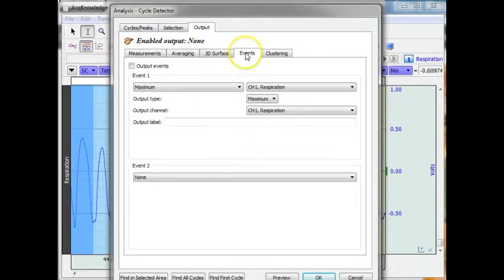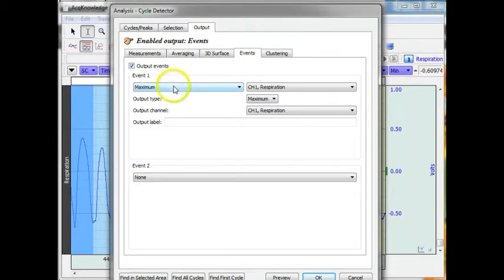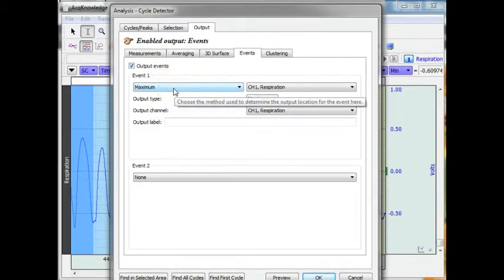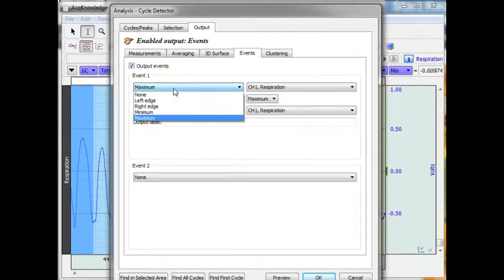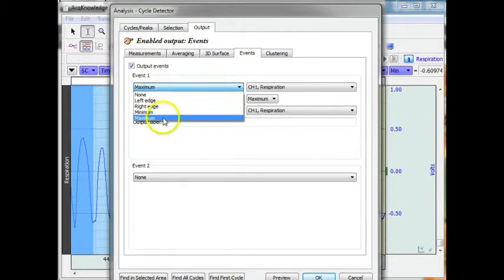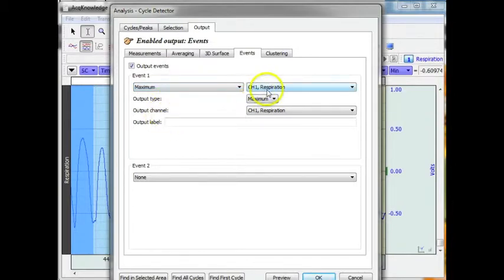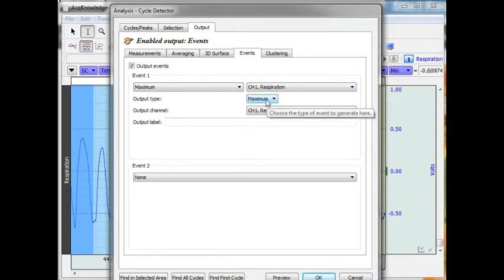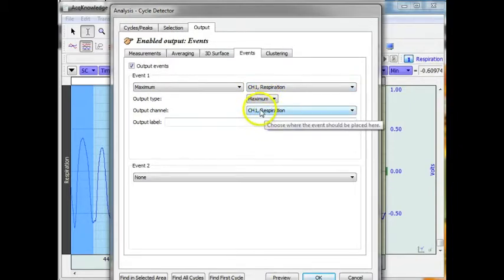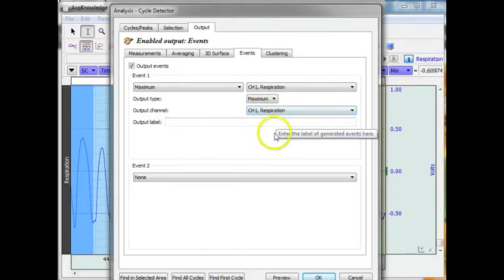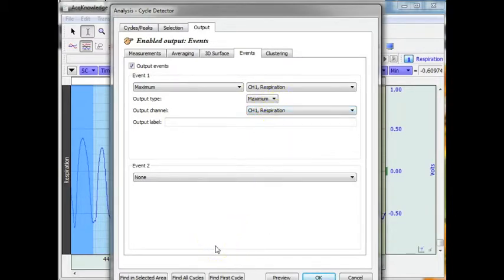And on output, I am going to turn my output events on. I am going to place a mark or an event mark at the maximum point on the respiration signal and I am going to use the maximum marker which is an upward arrow and the marker will be located right on the waveform itself.